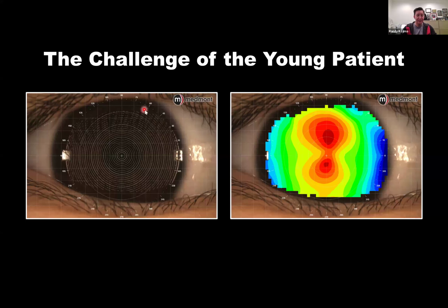In this case, you can see the shadow from the lid and then the eyelash shadows coming down quite far on both sides. And the information at 12 o'clock and 6 o'clock is really cut off. Como pueden ver, en la parte superior tenemos las sombritas por el párpado superior, además de las sombras dadas por las pestañas, tanto en la parte superior como inferior. Y obviamente la captura en esa área pues, está un poco limitada.